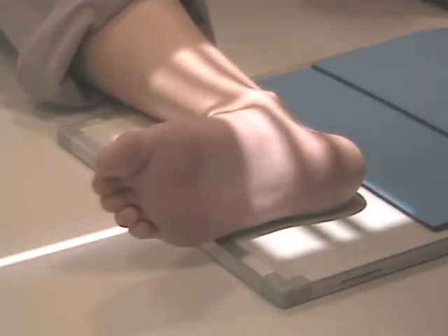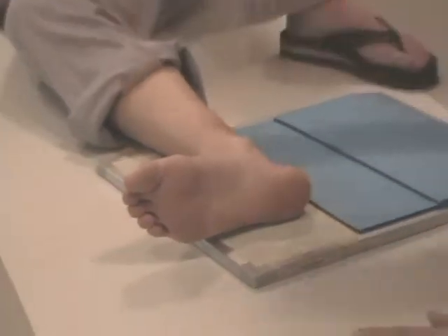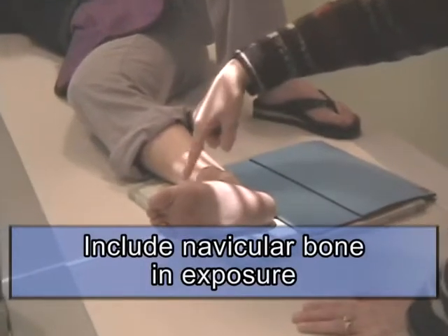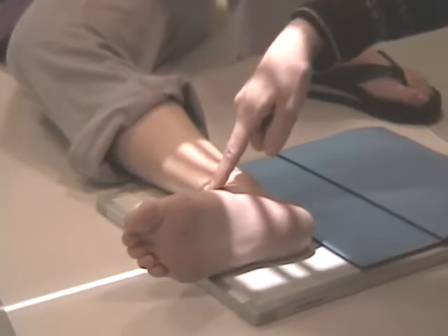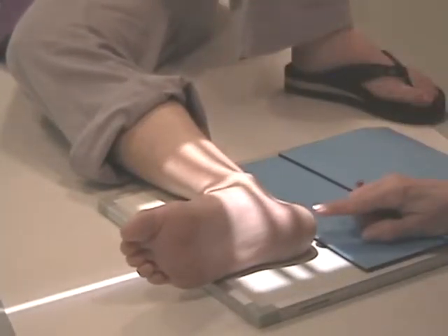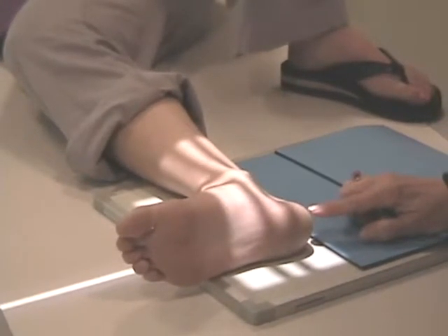We're going to do a little bit of finessing with this procedure now. We might as well start with the lateral. I want you to make sure that the navicular is included. Okay? Right here. Make sure you get enough of the foot on there to where the navicular is included. It might be necessary for you to clip a little bit of the os calcis if this patient had a bigger leg. Okay? The os calcis is not a part of the ankle joint.